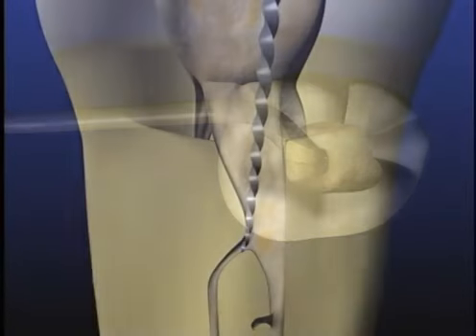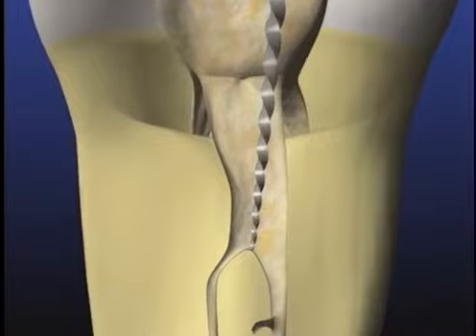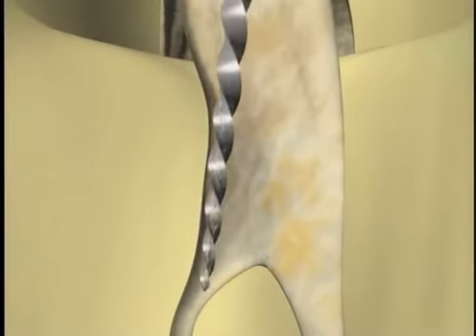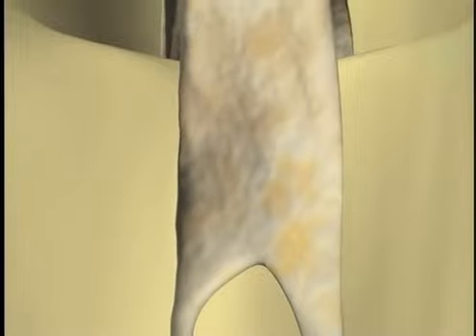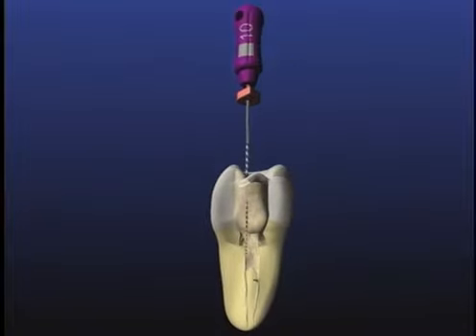Properly curved and a few short pull strokes begins to remove restrictive dentin. A few more strokes begins to improve the glide path. Gates Glidden drills can now be used to flare the orifices. This facilitates the subsequent introduction of small hand files.